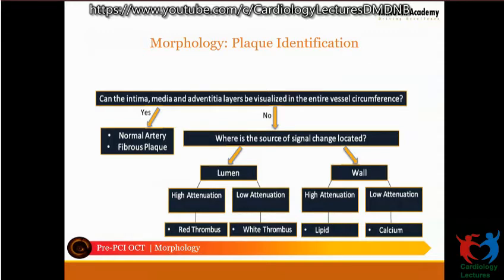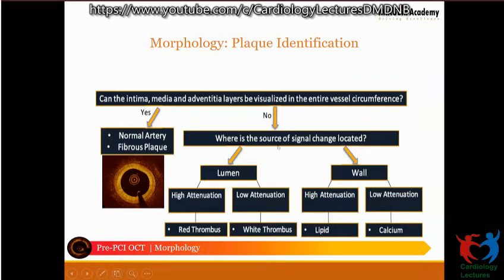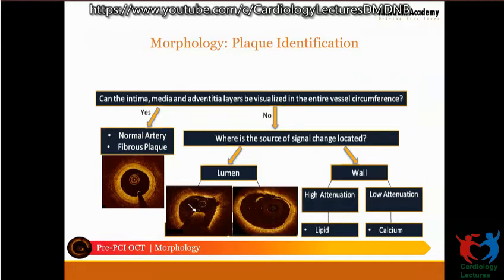In very simple terms, if I have to summarize this, when you do the OCT, you look for the change in the OCT image as to where the change is taking place. If you are in a position to identify intima, media, and adventitia, then you are dealing with either a normal vessel or a fibrous plaque. Thereafter, if there is some abnormality, you have to choose where the abnormality is located. If the abnormality is located in the lumen with high attenuation, then it's a red thrombus. If the abnormality is located in the lumen with low attenuation, that means the light can go all across, then you're dealing with a white thrombus.